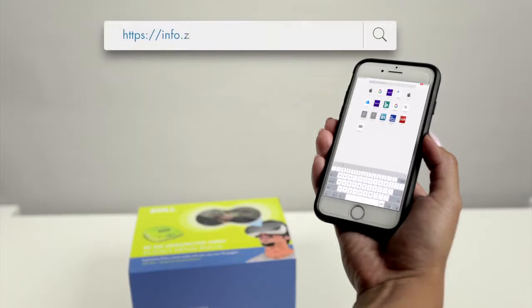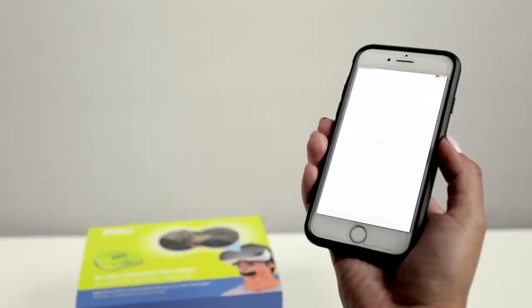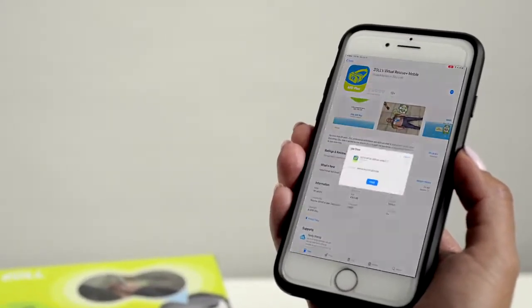To download the app, you'll need to go to ZOLL's VR Plus mobile landing page. The landing page includes instructions for both iPhone and Android devices, as well as system requirements for each. The app is best downloaded in an environment with a good Wi-Fi or cellular connection.